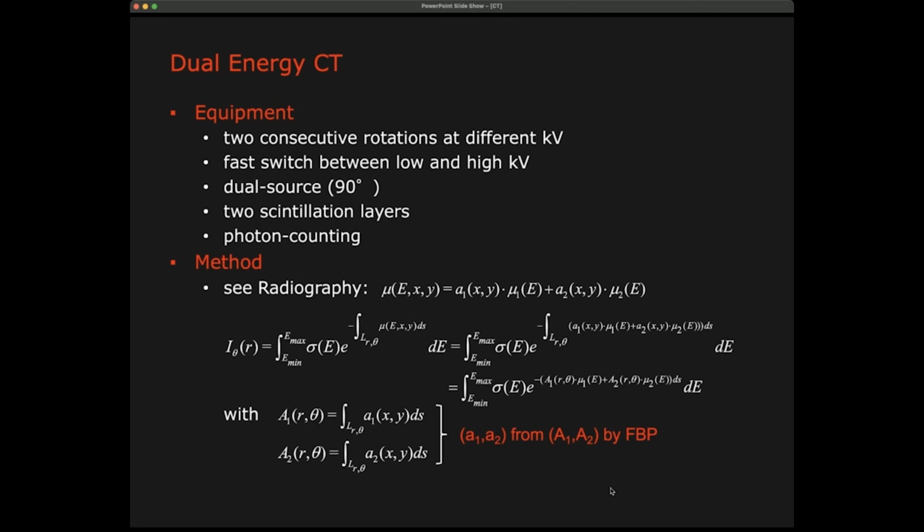One simple way to do it is to do, for example, two scans at two different energies. With classical equipment, you can just change the setting of your X-ray tube. As I told you before, if you reduce the voltage over your X-ray tube, you will reduce the energy. This way, you could scan with two different energy distributions and then compare. So that's one thing to do.